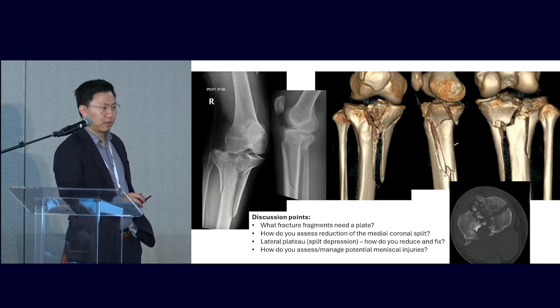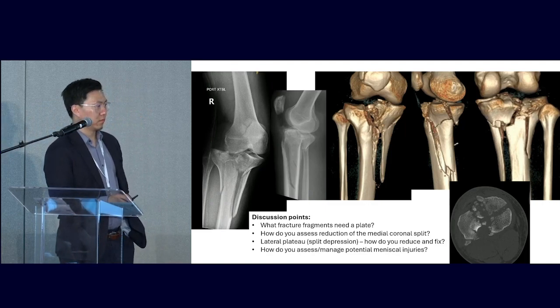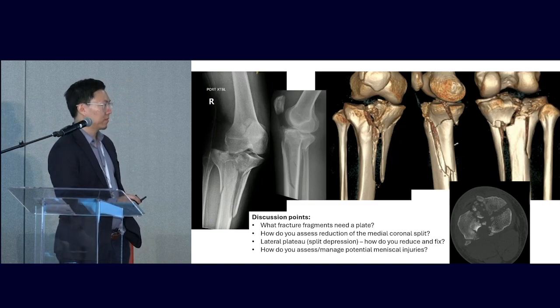All right, so how are we going to go about this? Kyle, how do you make a determination about the incisions for your fixation based on what you see on the 3D CT? You don't want to really know what I do with my incisions because I think it's different than everybody in the world. I go straight anterior, and if I have to go posterior, interestingly enough, the ones that have this posterior piece don't go on to get total knees very often. That's the most important part because it's A to P instability.